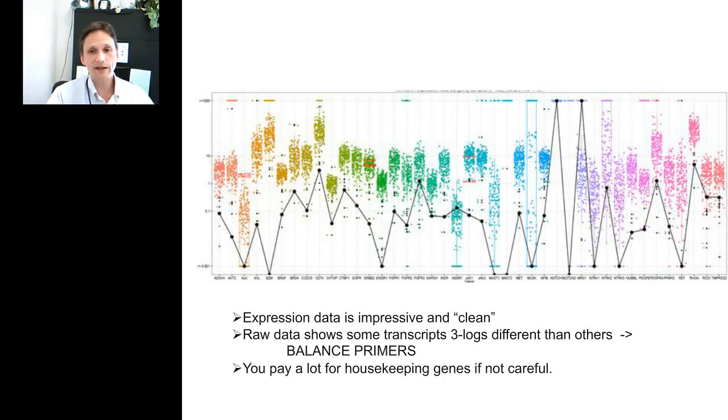expression profiling. This is a summary of our 50-gene fusion panel. These genes are on the bottom. The genes themselves are not really critical, other than to show you the data actually looks quite good using this normalization procedure that Song Lee has come up with. It's a log scale over here on the y-axis. This is a summary of 200 different samples per gene, so this cloud is 200 different samples. And you can see widely variant expression from 0.1 up to 100, so you can have 3 logs or more of difference of expression using AMP-based expression profiling.